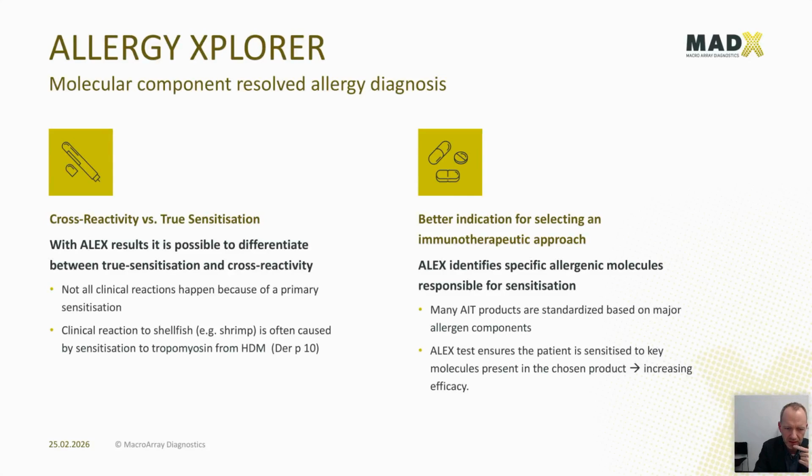This brings me to the last point: the ALEX test is a better indication for the selection of immunotherapeutic approaches, as it provides specific information at the molecular level and identifies the allergens responsible for the patient's particular sensitization. Most immunotherapeutic products are standardized to the major allergen components.